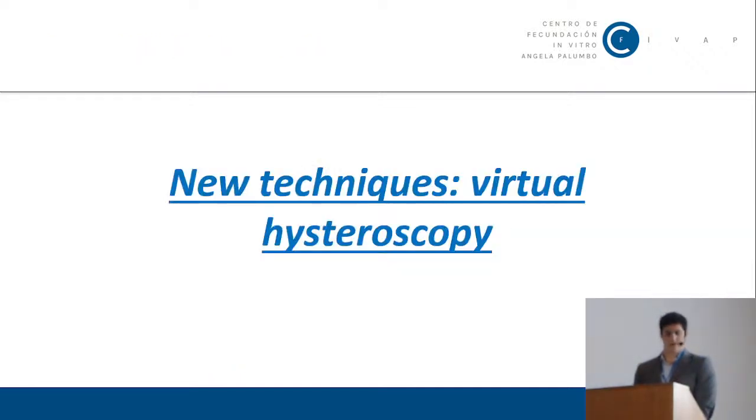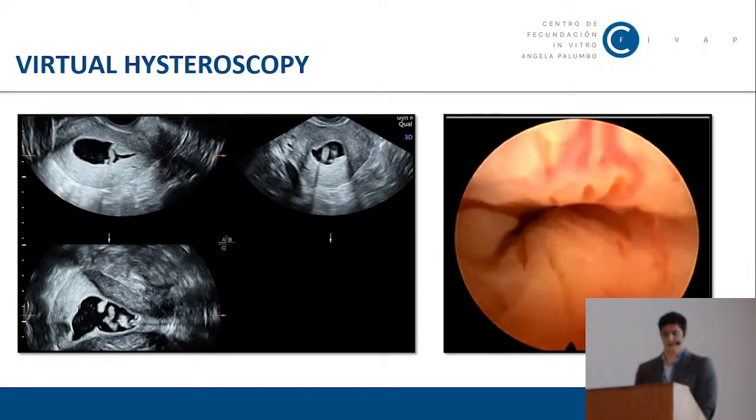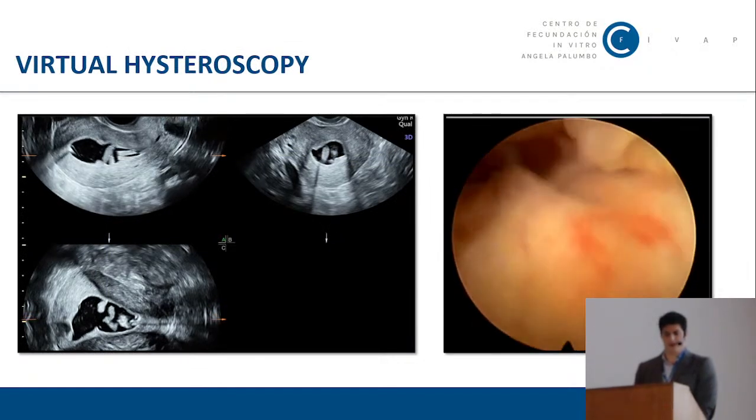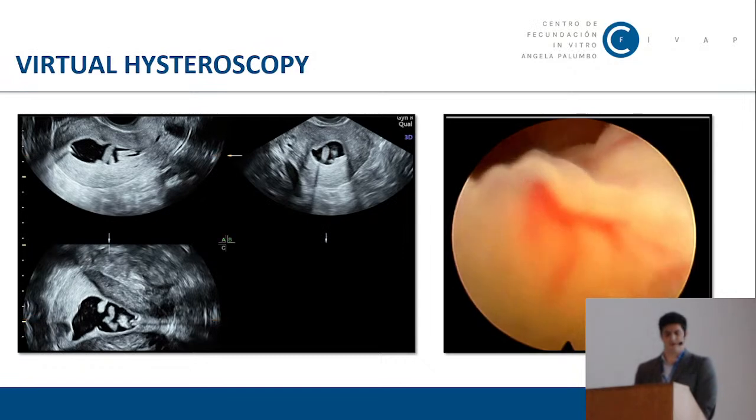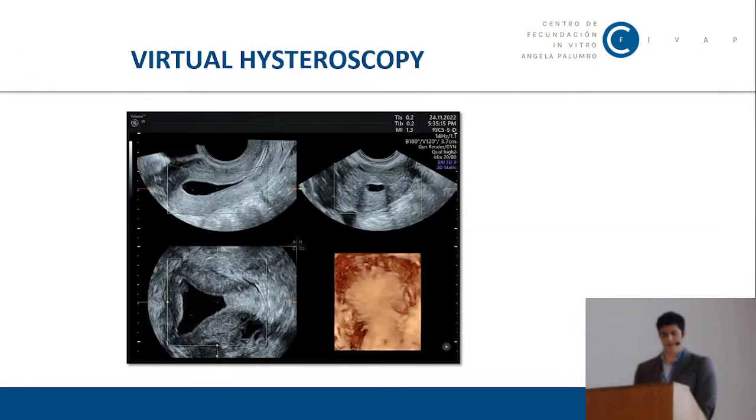And I'm going to talk about a new technique named virtual hysteroscopy. In this first video, we observe how, while performing a hysterosonography, we obtain a clear image of the interior of the uterine cavity. In this case, we observe a uterine cavity with multiple endometrial polyps.